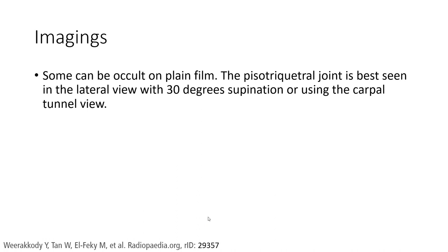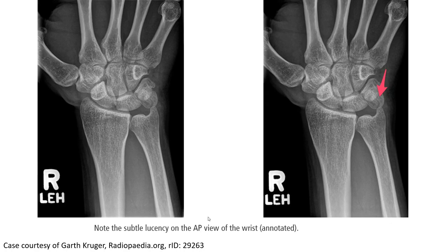The pisotriquetral joint is best seen in lateral view in 30 degree supination or using the carpal tunnel view. In this AP wrist x-ray, we can see the pisiform fracture with a lucency line across it.